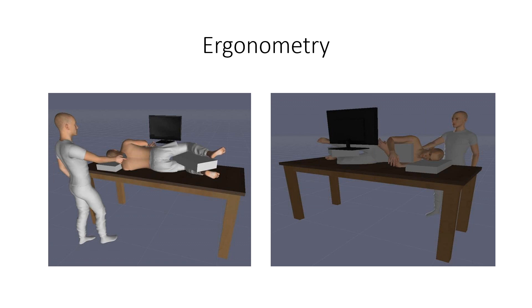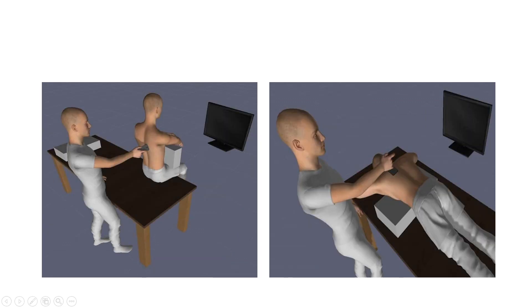The patient can be placed in several positions for the ESP block: lateral position, sitting position, or prone. The operator, patient, and ultrasound scan should be in a straight line. For trauma patients, the sitting position is usually more comfortable and requires less movement. The prone position is the most ergonomic for the operator since it is easier to slide the probe laterally, up and down, rather than against gravity.